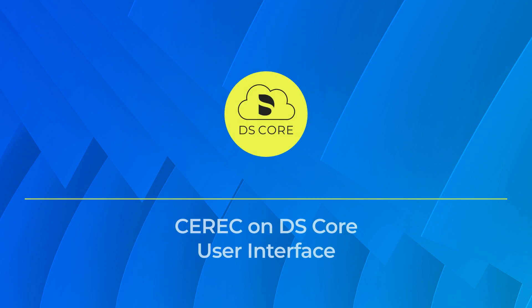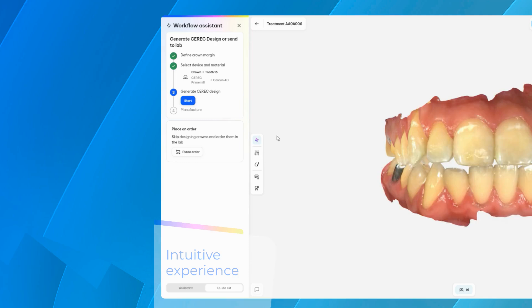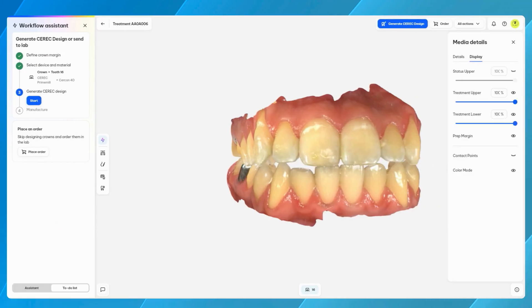The following tutorial describes the CEREC-ON-D's Core User Interface. On the left side of the screen is the new Workflow Assistant, clearly highlighting the planning steps from drawing margins all the way to Send Design for Manufacturing.